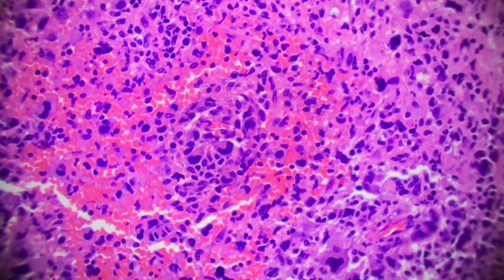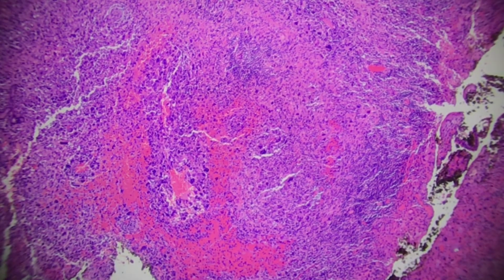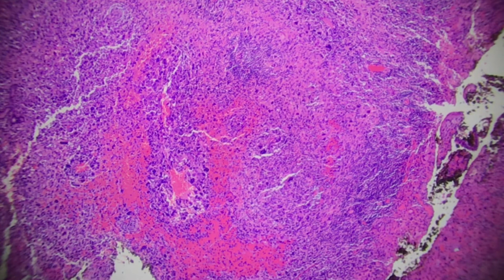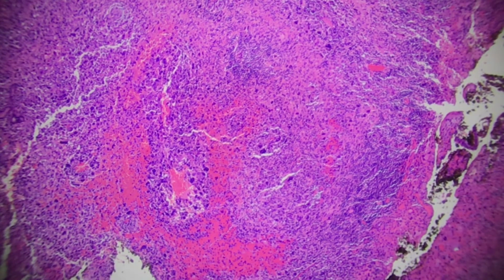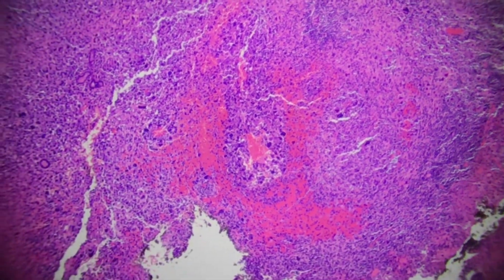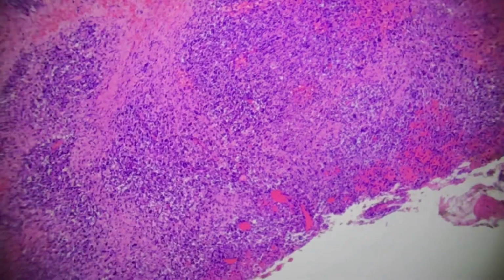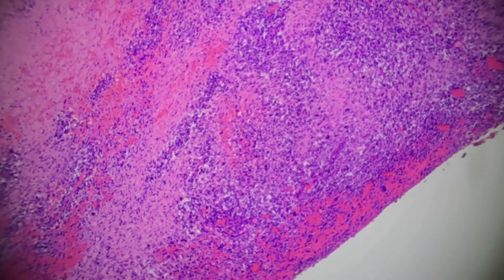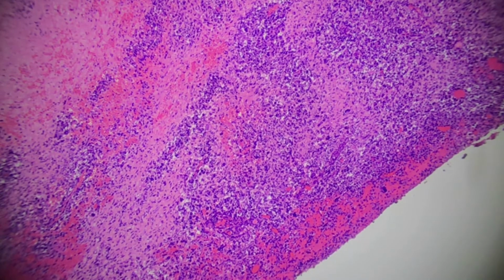Your differentials, particularly when they're amelanocytic, like this one, not really seeing pigment in this, is your large cell lymphomas, which should not be positive for Melan A or melanocytic markers. Okay, and another thing to consider, then this one also has this, is the epithelioid types is, what if this is a poorly differentiated carcinoma? Well, then our cytokeratins should be positive at some point. So if you did a broad spectrum cytokeratin, like AE1/AE3, CK5/6 would probably be a popular one, sinonasal, so you could even consider doing something like P40. Okay.